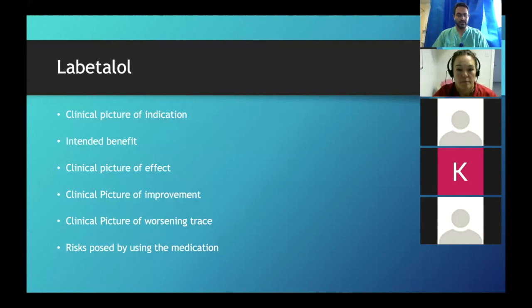Decelerations, would they be there? Yeah. So decelerations would be there because they are triggered by the parasympathetic. These are vagus nerve, yeah? Okay. Now, so you basically have described a trace that has a low baseline, reduced variability, still some accelerations when baby's moving, and there's still decelerations if we get cord compressions and if we are getting hypoxia or hypoxic events.